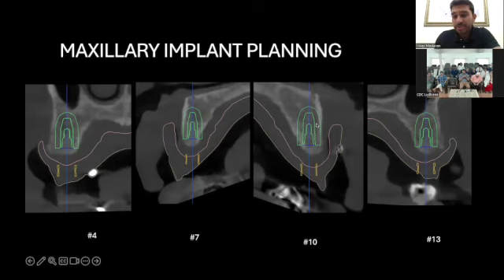And sometimes you don't have a choice, the bone typically indicates us to place an implant at an angle, but at least if you have a plan, if I were to angulate an implant, you can compensate for it. Maybe if you're doing an overdenture with very severe angulations, you could use an RTX locator, or you can use a bar on top of the implants if they're too angulated. So that kind of gives me an indication.